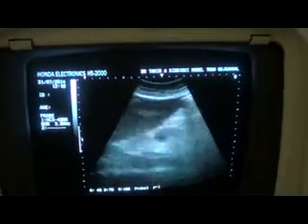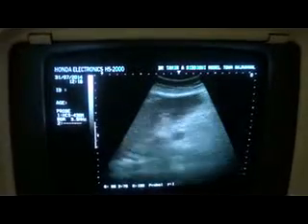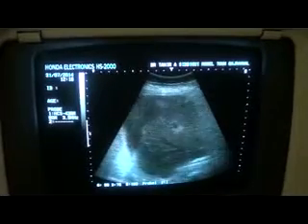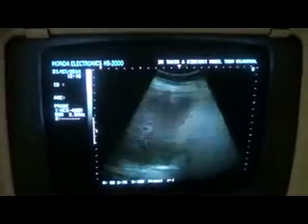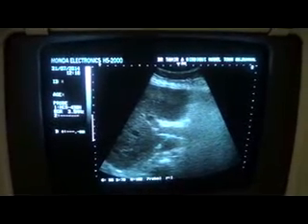The echogenicity of the liver is slightly decreased, but not significantly. This is the right lobe of the liver. In longitudinal section, this is the transverse section showing the portal vein. Periportal echoes are very prominent, and that is a usual finding in cases of diffuse decreased echogenicity. You can see how bright the periportal echoes are.